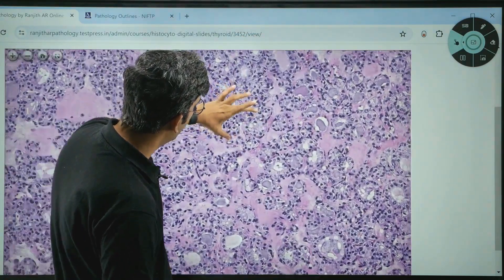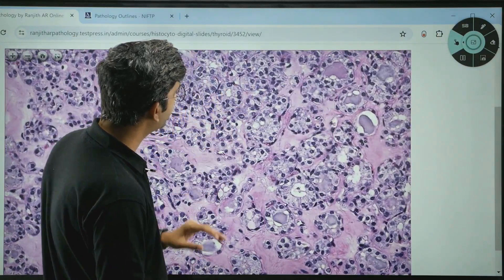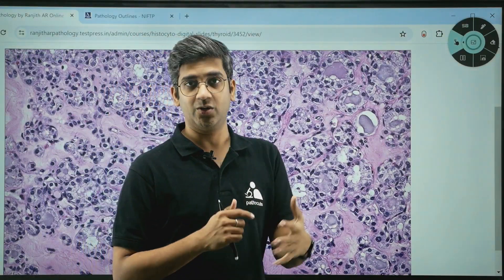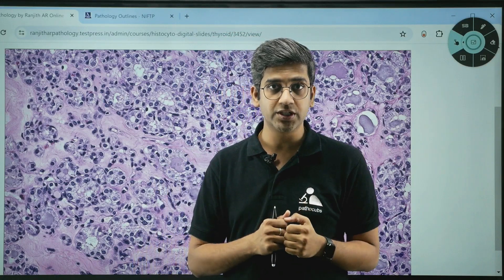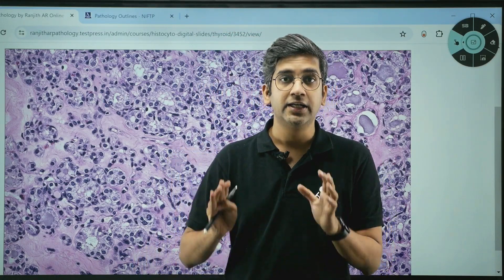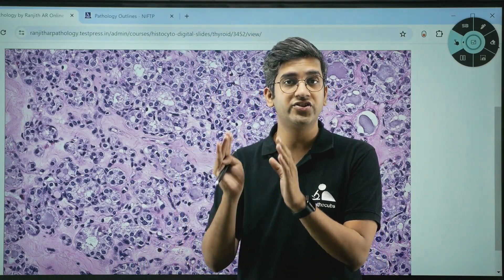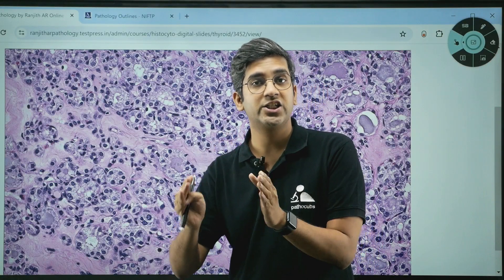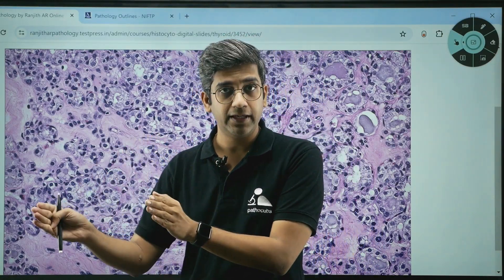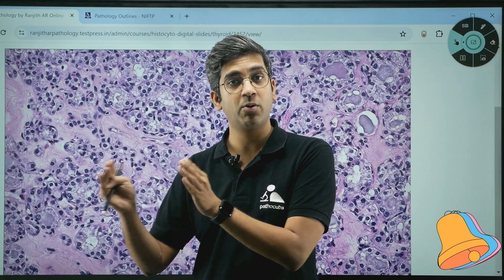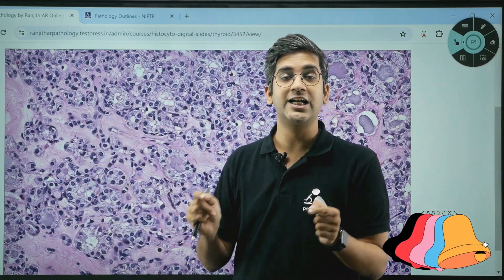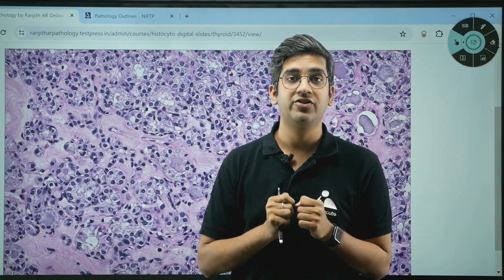Now, let's look at the nuclear features. If you zoom in further, the nuclear features here may show crowding, pseudo-inclusions, and classical orphan Annie eye nuclei. The nuclear features are suggestive of a papillary tumor — but no papillae, less than 1%, no psammoma bodies, and completely repetitive micro follicles. That's what NIFTP stands for.